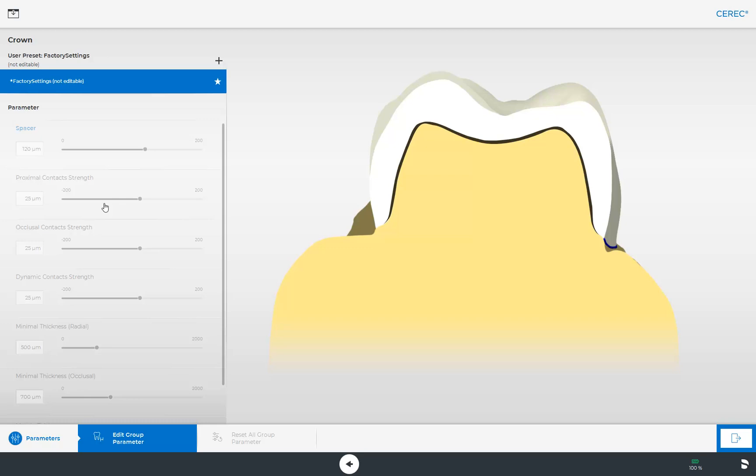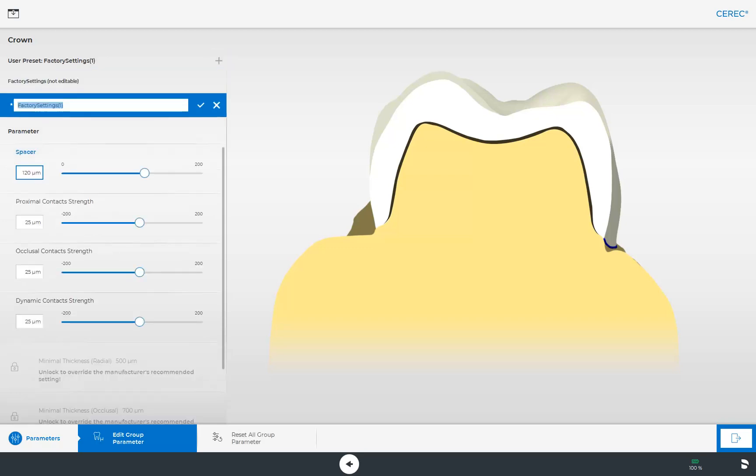However, you have the option of creating individual parameter profiles. To do this, tap the plus sign, which opens a new bar so that you can enter a name for your profile. This is helpful if, for example, several dentists work in the same practice and like to work with different settings.